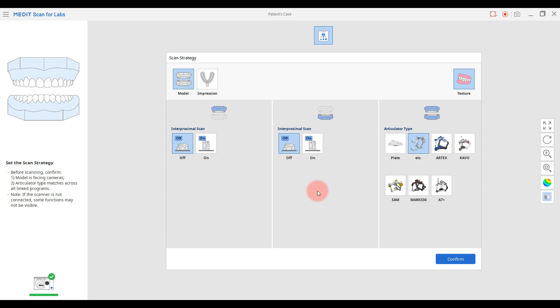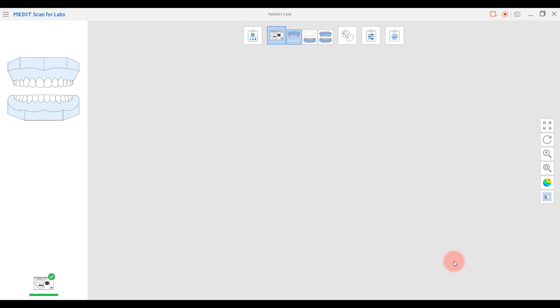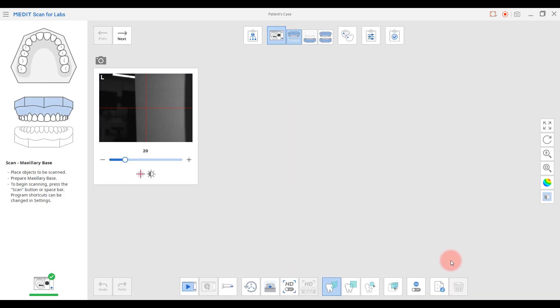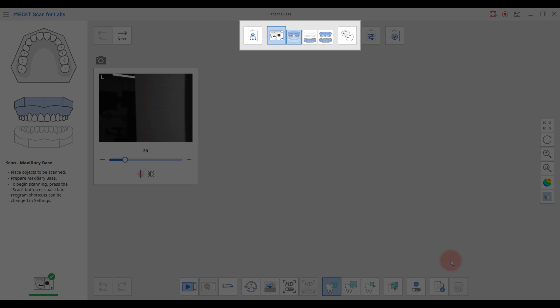We'll demonstrate with OFF and add some more details later with ON. You'll see the scan stages on the top of Medit Scan for Labs. We'll proceed with scanning as the sequence appears: upper base, lower base, and bite.